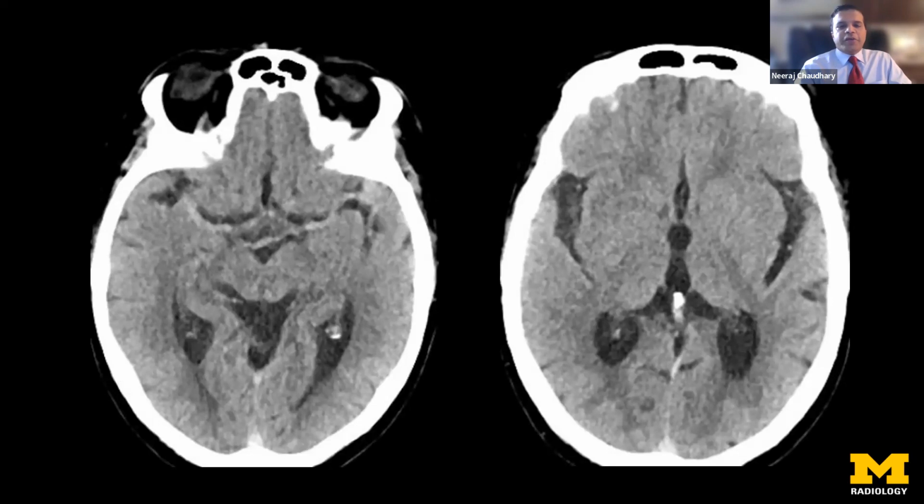So as we can see here on the CT, non-contrast CT head, vessels at the base of skull, which is, if I can point my arrow, yeah, there we go. So at the base of skull, suprasellar cistern, where the circle of Willis that most of us will know, and more for trainees who are joining in on this talk. Middle cerebral arteries as they course laterally to supply all of the cerebral hemisphere bilaterally. So you're looking at hyperdensity in those vessels where acute clots will have hyperdense signs. On this particular patient, we don't see that specifically in the M1 segment.